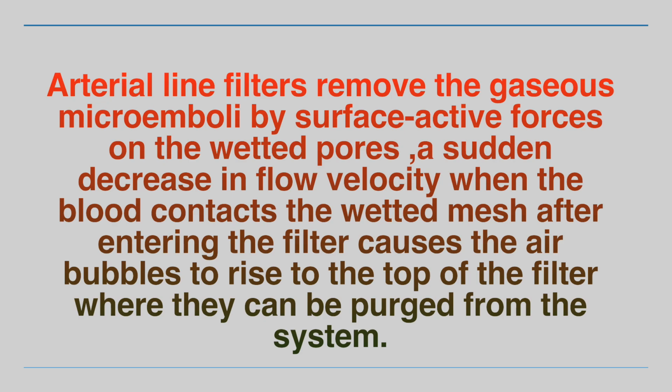Line filters remove the gaseous microemboli by surface active forces on the wetted pores. A sudden decrease in flow velocity when the blood contacts the wetted mesh after entering the filter causes the air bubbles to rise to the top of the filter where they can be purged from the system.